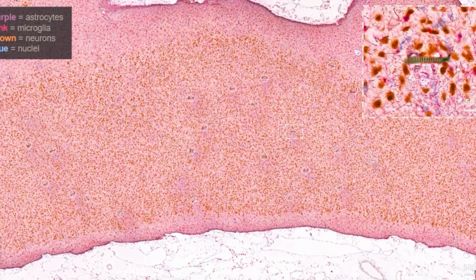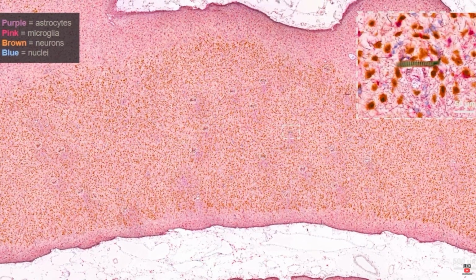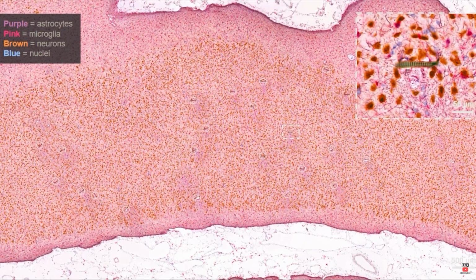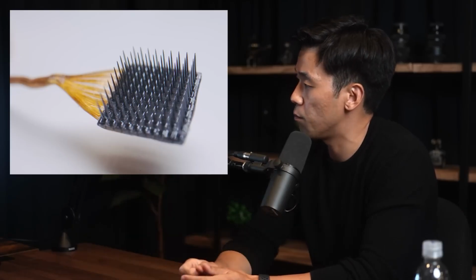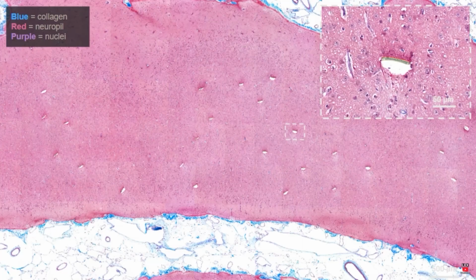Here's an image of brain tissue from an animal that had the chip for 7+ months. It has different cell types, and neurons are highlighted in brown. That little stripe is the threads themselves. The neurons lie right next to the thread, meaning trauma is minimal. Earlier chips before Neuralink damaged neurons around them. They didn't conform to the thread. The second image shows that these threads don't float around. They stay exactly where they were placed.